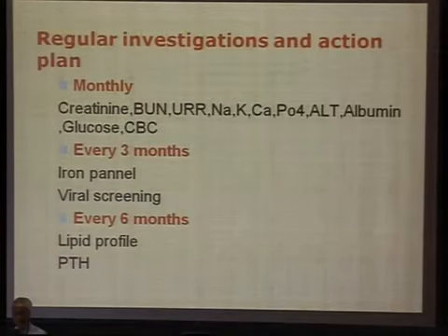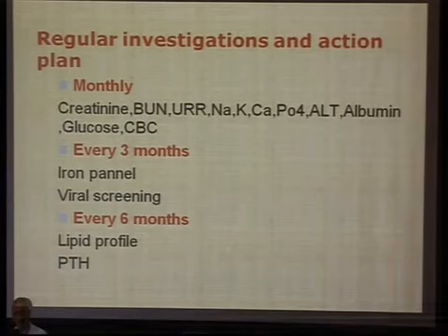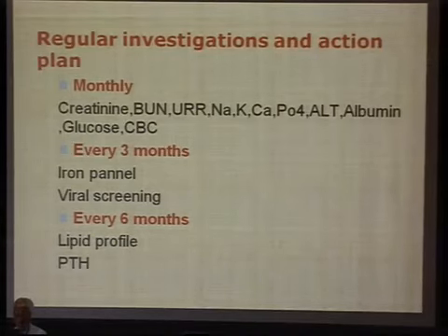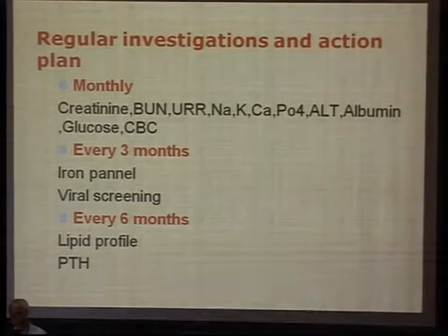Also regular investigations: monthly investigation, investigation every 3 months, and investigation every 6 months. Don't treat anyone by chance. Anything you are doing in dialysis, there must be a policy and procedure in your manual. And there must be one answer from all doctors, all nurses, and all workers working in the hemodialysis unit.